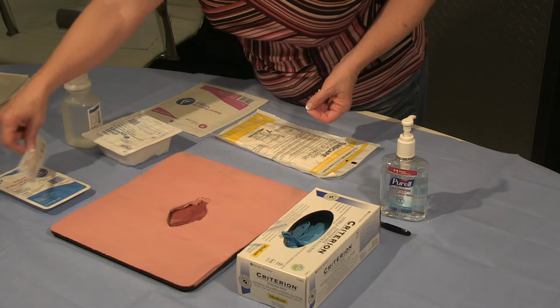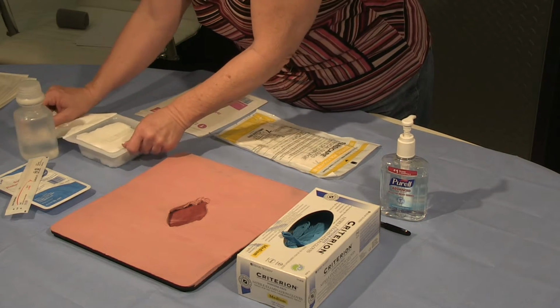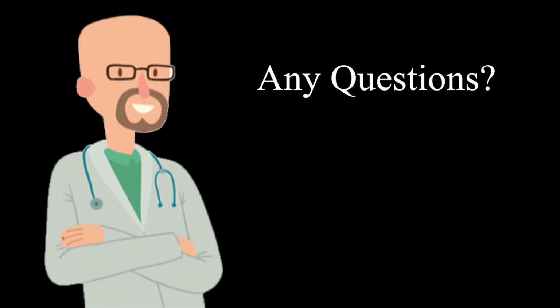In the absence of odor or discharge, I will proceed to open my sterile supplies, establish a sterile field, don sterile gloves, apply a wet dressing to your wound, cover it with a dry dressing, time, date, and initial your dressing, and chart the dressing change in your record. Any questions? If not, with your permission, I will proceed."